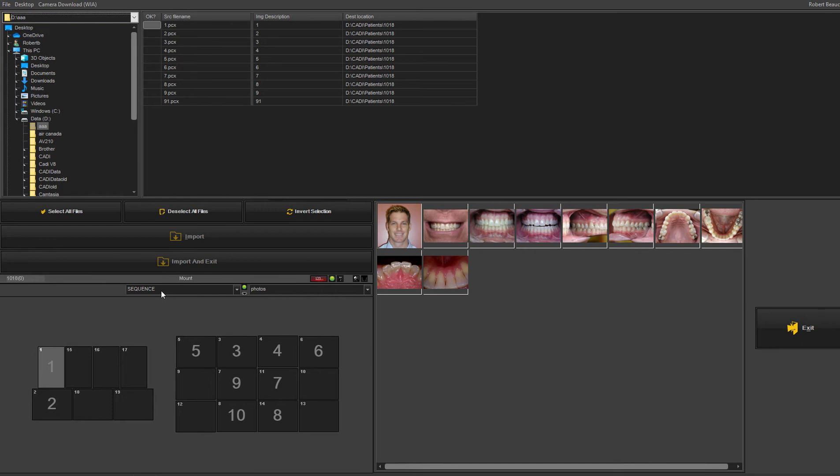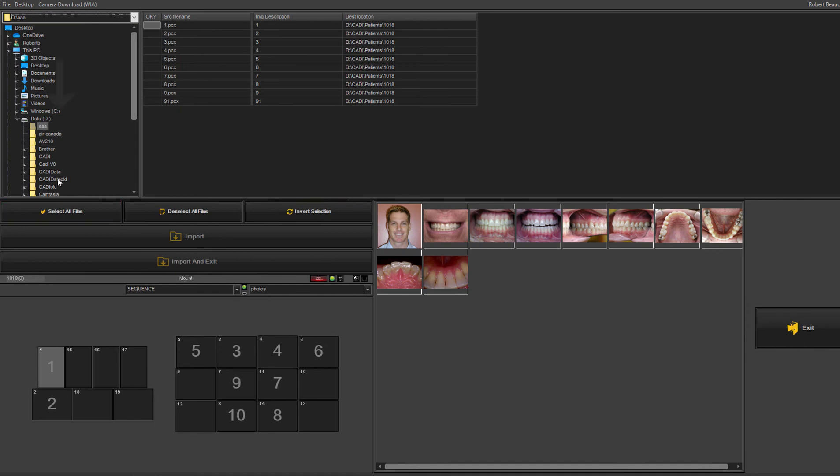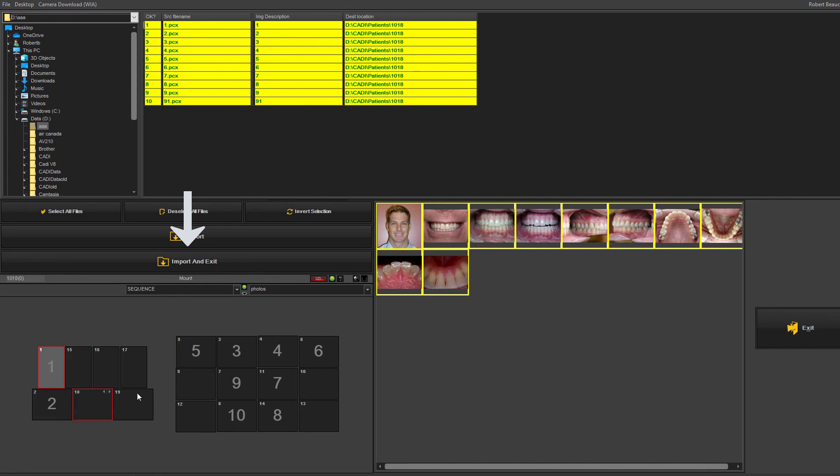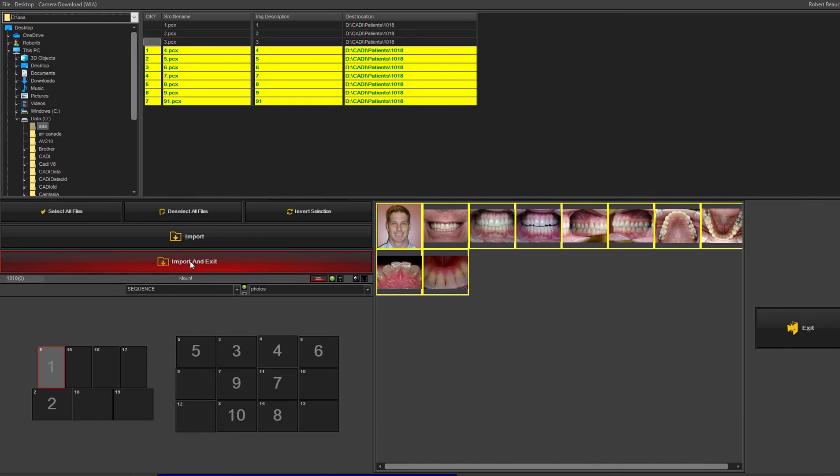They take all the pictures in this sequence that you train them on. They come and plug the card reader or camera to the computer. On the computer in the software, you're going to hit that icon that we hit before, that little arrow coming in, which means importing into the software. What the staff is going to do next is just go select all files. They're going to click on import and exit. And if the right sequence is chosen, they will all be placed in the proper positioning, in the proper orientation, and you just click import and exit.